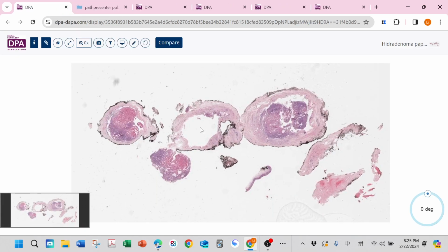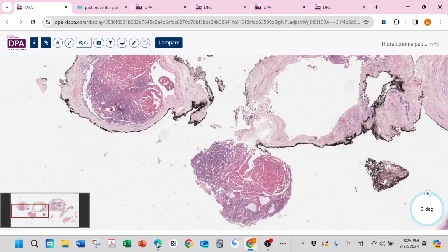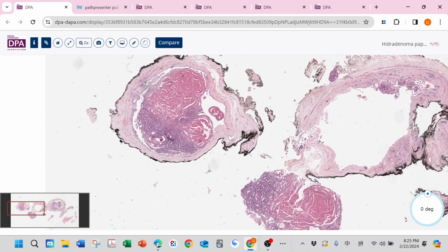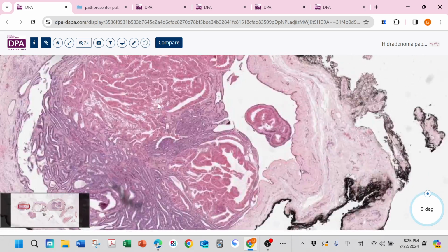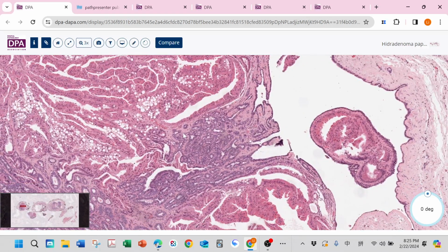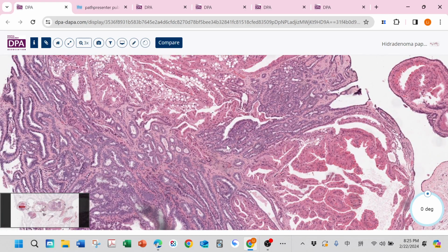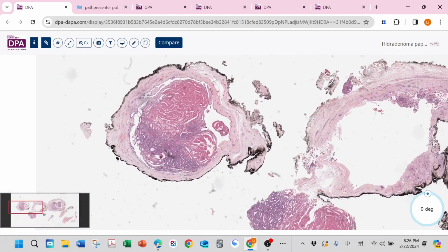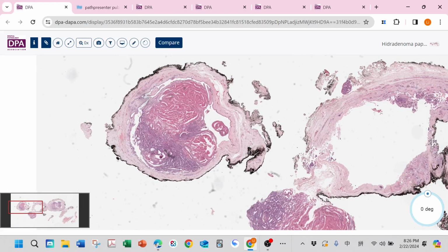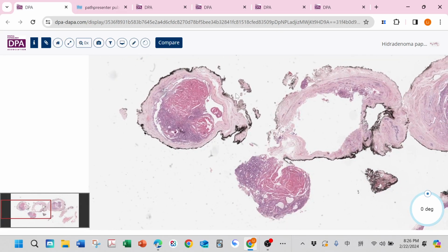One more example, they also look the same. Dermal nodule with this maze-like structure. This one, I think, has kind of eosinophilic cytoplasm, like apocrine gland differentiation in this area. And this one is the classic apocrine gland differentiation. Well demarcated lesion, maze-like structure, two-cell layer. Really good for Hidradenoma Papilliferum.